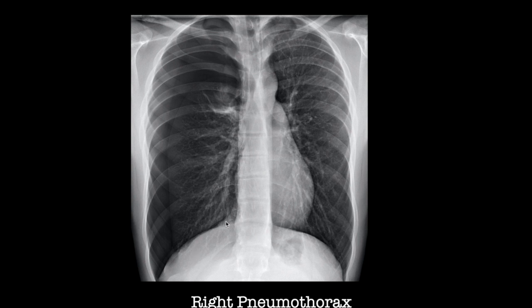Here's another example of pneumothorax. On the left side you can see normal lung markings going all the way out to a centimeter from the inner chest wall. But here the lung markings stop, you see an edge, and then air on the outside — so this is air in the pleural cavity. This is another pneumothorax. In this case, there is no midline shift, so this is a simple pneumothorax.